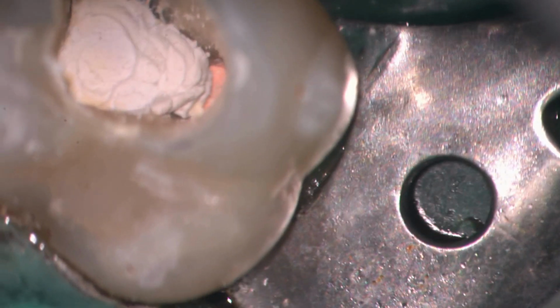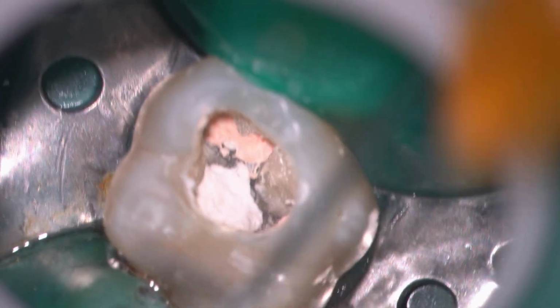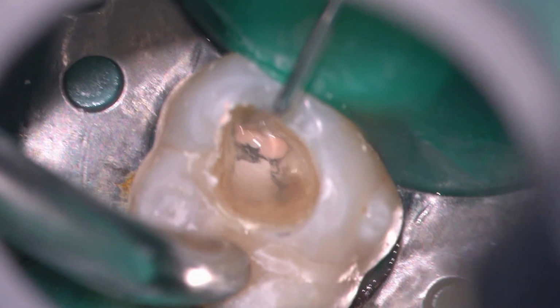But it's very important to have a thin layer of Cavit covering the Biodentine, because it's known that if you etch and bond at the same time you place the Biodentine, it disrupts the set and integrity of the Biodentine. You don't want to etch, bond, and place a resin directly over the Biodentine. Cavit is a very effective and acceptable base material to place over the Biodentine before you etch, bond, and place a composite resin.